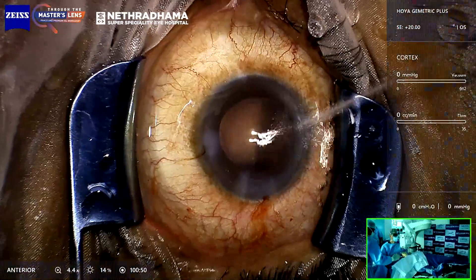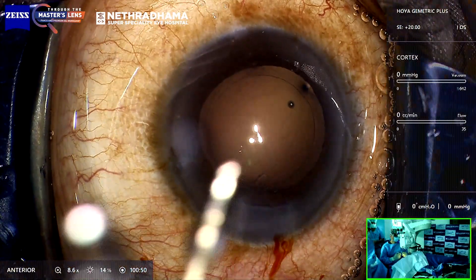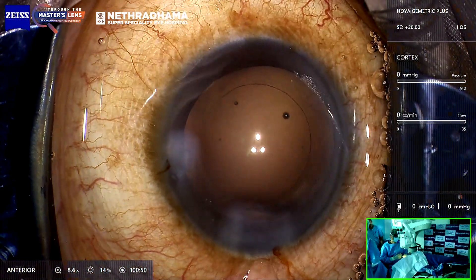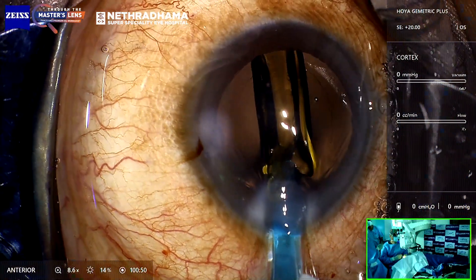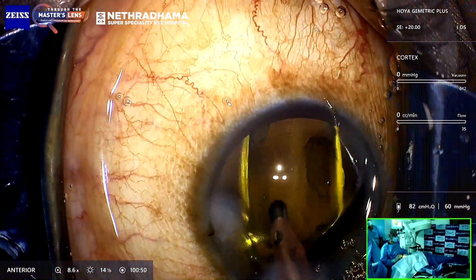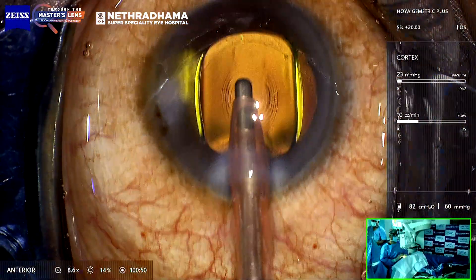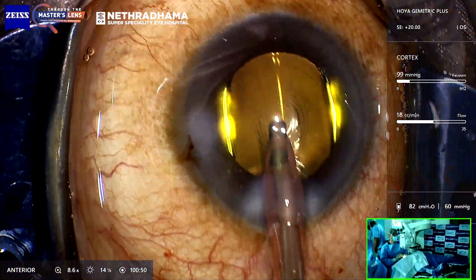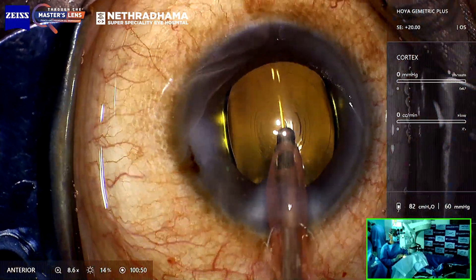What I'm showing you is insertion under BSS, because I don't use an irrigating cannula — I just form the AC with BSS. I go in through the wound and inject it into the capsular bag. It opens up smoothly. Then I go in with my coaxial and nudge it into the bag. You can see it's beautifully centered. The lens opens up very quickly — the unfolding time is quite good, so you don't waste time. This is very important for toric lenses, because if the lens does not unfold fully before you finish the surgery you can have rotation and misalignment.